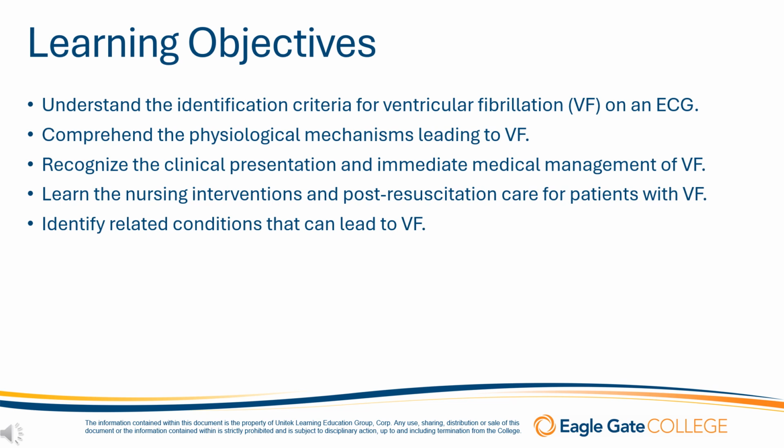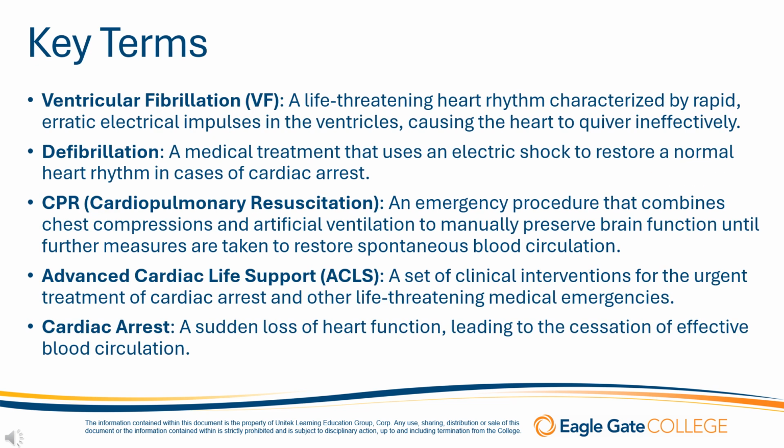Let's take a look at the learning objectives for this presentation. By the end of this presentation, you will be able to understand the identification criteria for ventricular fibrillation on an ECG, comprehend the physiological mechanisms leading to ventricular fibrillation, recognize the clinical presentation and immediate medical management of ventricular fibrillation, learn the nursing interventions and post-resuscitation care for patients with ventricular fibrillation, and identify related conditions that can lead to ventricular fibrillation.